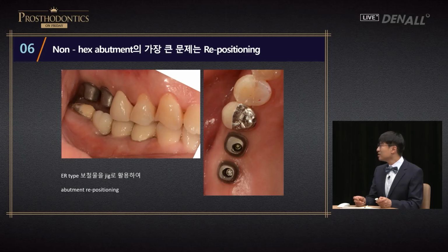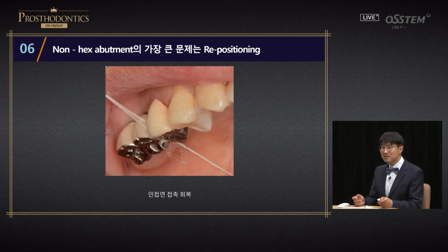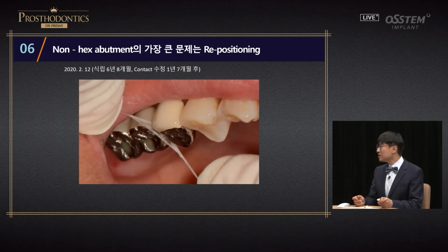When you adjust the contact, if you just do it randomly, then there can be a lot of difference. In that case, you cannot use prosthesis as jig, even if it is a 2-implant case. If you're going to adjust contact, you need to take implant level impression or do pickup impression. It is important so that there is a little difference in terms of contact.